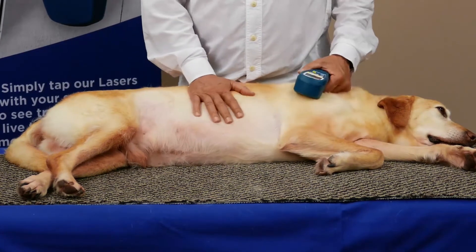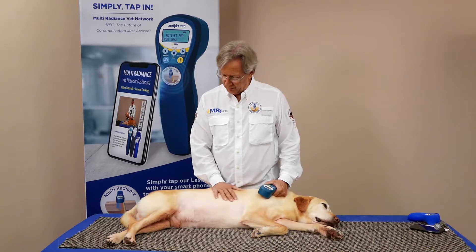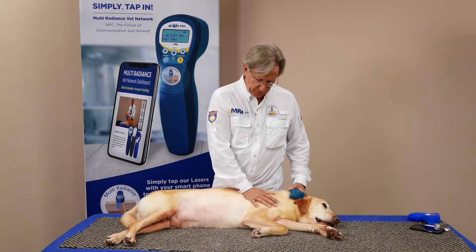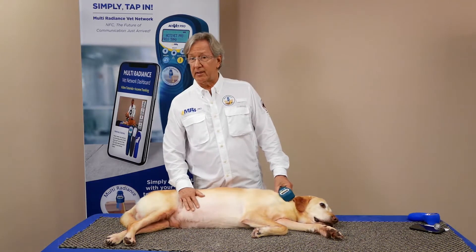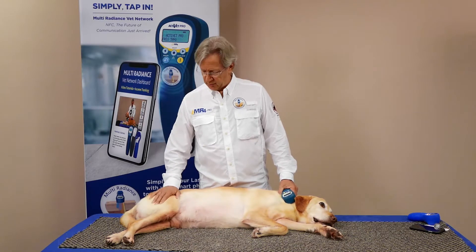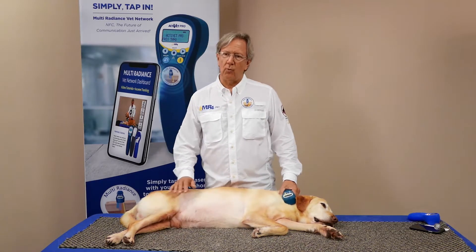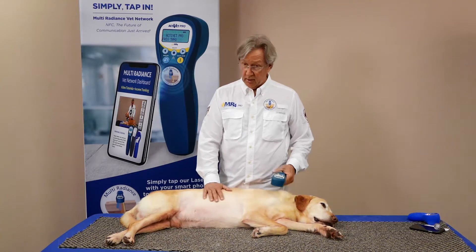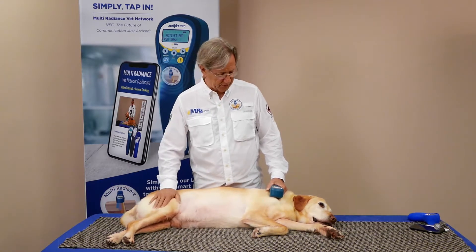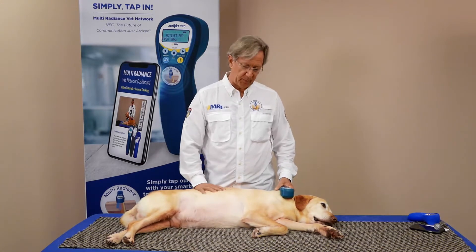That's what's so nice about laser therapy — you're getting a nice endorphin response, you're not getting any pain reactions, you're not getting any overheating or thermal overloading of tissues. Consequently the animal stays very nice and calm. That's what makes our rental laser program so popular too, because when the animal gets to stay home to continue those treatments the vet has prescribed, everybody's relaxed. This is the ideal way to get the best outcomes from your laser therapy.